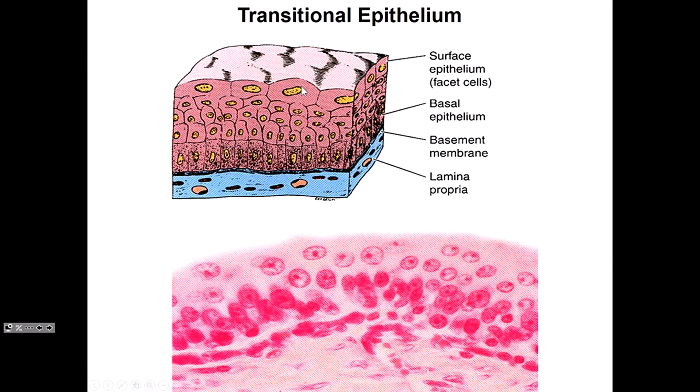And in the bladder, sometimes we see, not shown here, binucleated cells in that uppermost layer. That's the giveaway. In the bladder, that's a histologically unique identifying feature that tells you that that is bladder epithelium and not something else, okay? So you want to look for unique identifying histological features that tell you that it's this and not that, and that's going to make your life so much easier, okay? So that's transitional epithelium, most likely the bladder.